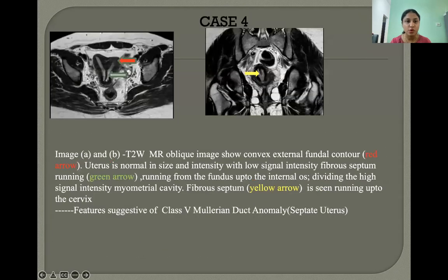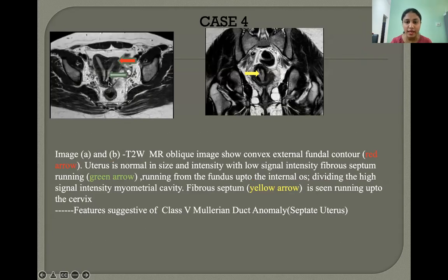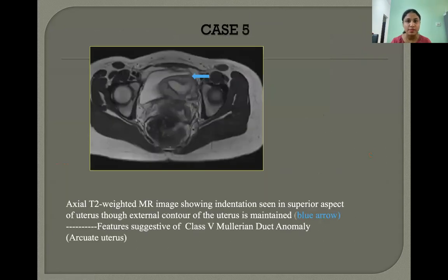Case 4: T2 MR oblique images A and B show a convex external contour of the fundus. The uterus is normal in size and signal intensity, with a low signal intensity fibrous septum running from the fundus up to the internal os, dividing the high signal intensity endometrial cavity. The fibrous septum is seen running up to the cervix. These features are suggestive of class 5 Mullerian duct anomaly, septate uterus.